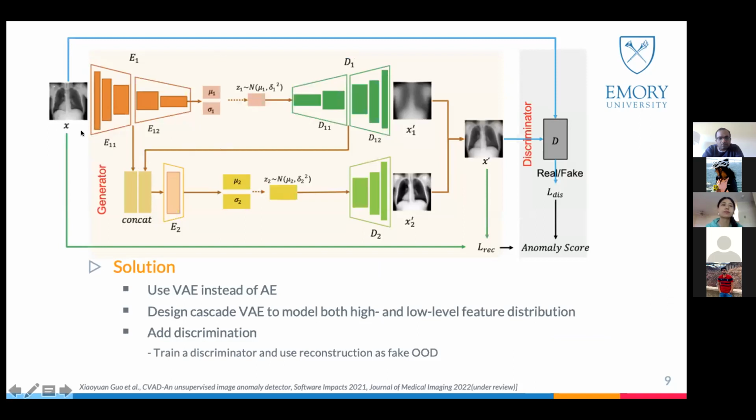This is the architecture here. We first have the original image, which is the in-distribution data. We think this input data is good and clean. We put this image into the first variational autoencoder, and we get some reconstruction. We use a set of parameters to formulate the latent parameters. Because it is kind of deep and we want to learn high-level information, the reconstruction is very blurry.